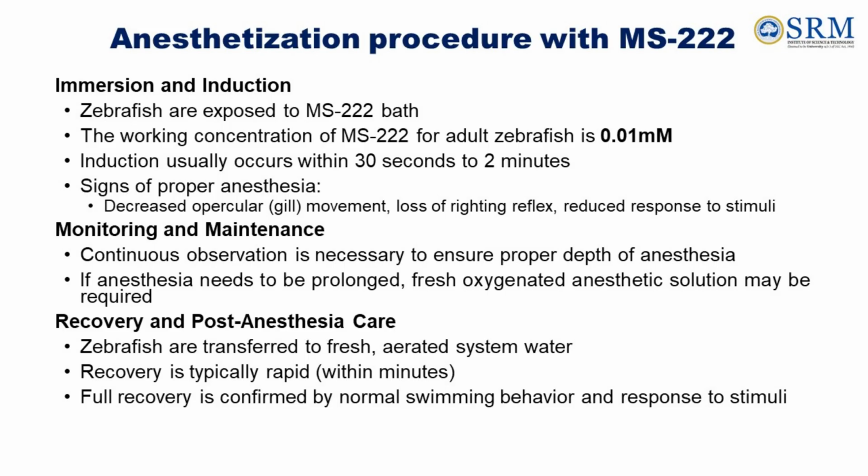The experimental zebrafish need to be exposed to MS-222 bath. The working concentration of MS-222 for adult zebrafish is 0.01 millimolar. Induction usually occurs within 30 seconds to 2 minutes. Signs of proper anesthesia are decreased opercular movement, loss of righting reflex, reduced response to stimuli.